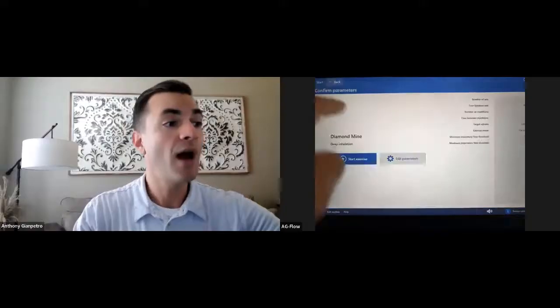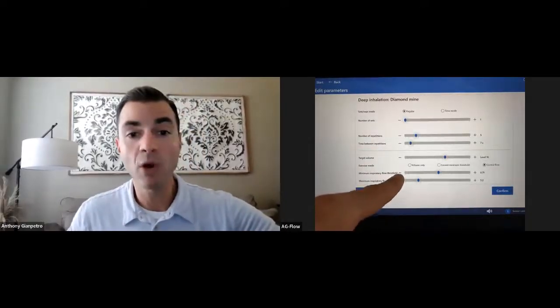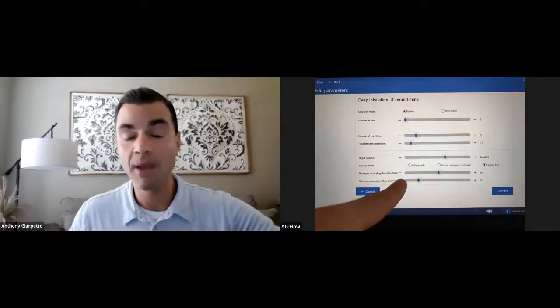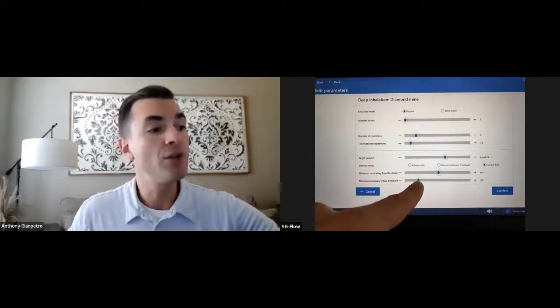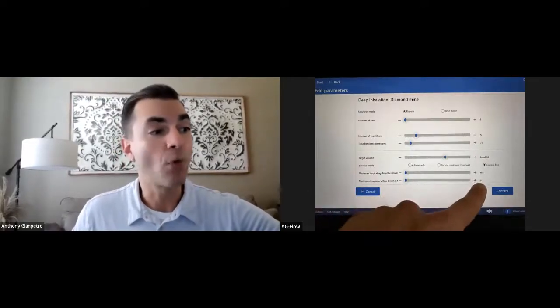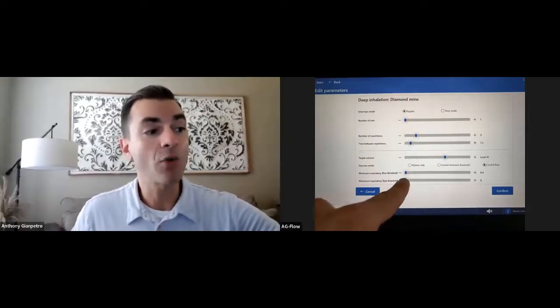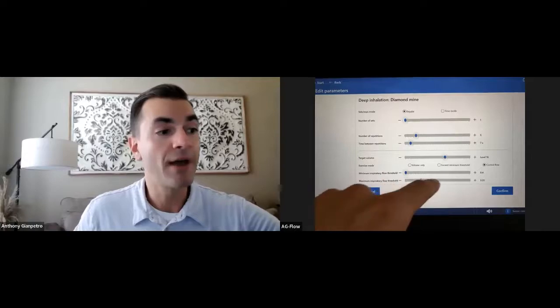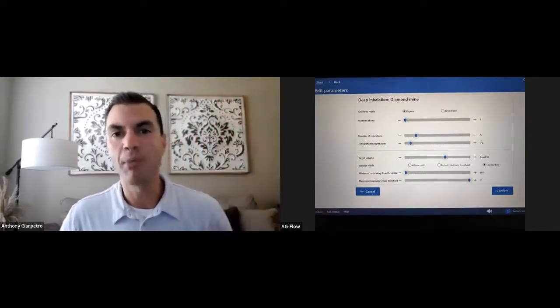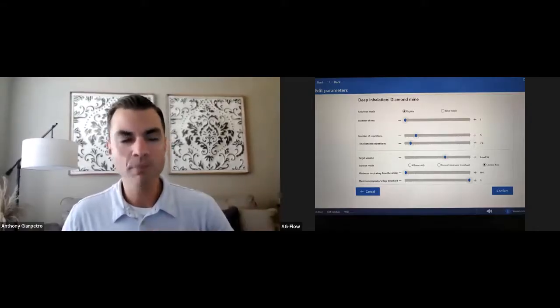But just to do a final recap. Notice that there's minimal inspiratory flow threshold and maximal inspiratory threshold. Think of that as stalactite on the top, stalagmite on the bottom. And you can see anything towards the left is going to be easier. It just gets confusing for the maximum inspiratory flow threshold, because all the way to the left is a higher number than all the way to the right. And that's why I think that little picture that I showed you might help you understand why it's harder, okay, even though the numbers are going down.